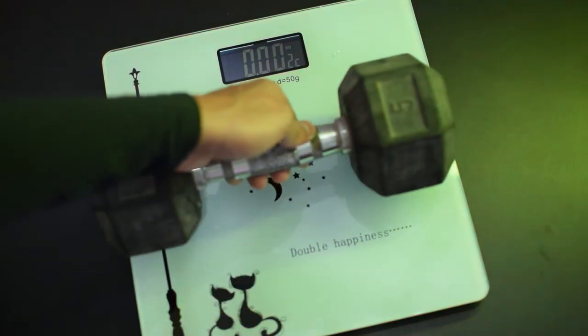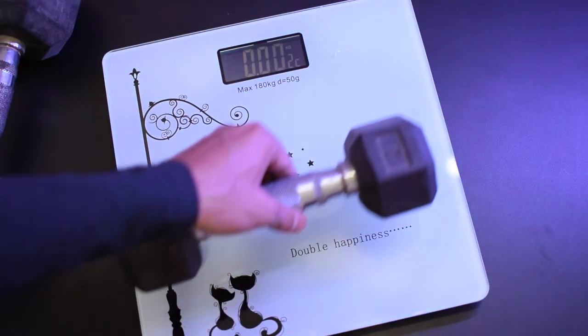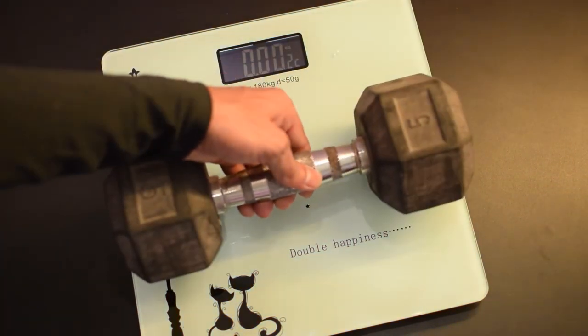First I put the 5 kg dumbbell and it shows the correct reading, as you can see. Then I put the 2 kg dumbbell and it shows 2.05 kg, which is almost accurate. So yes, this scale is perfect and shows accurate readings.